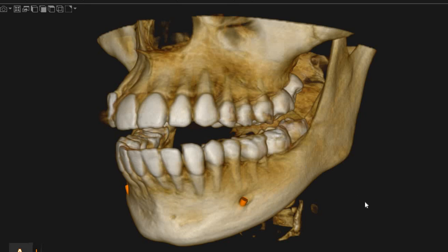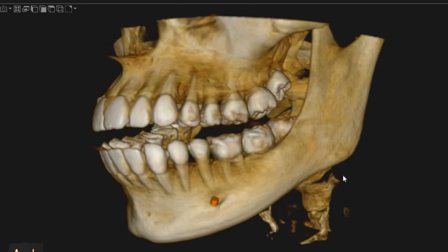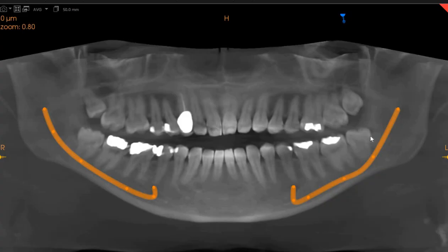Hello and Asalaamu Alaykum. Antra Scan Diagnostics here. This is the CBCT of the patient that you had requested. The area of interest is the lower left wisdom tooth and its association with the inferior alveolar nerve.